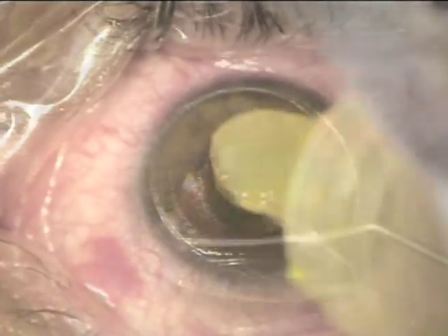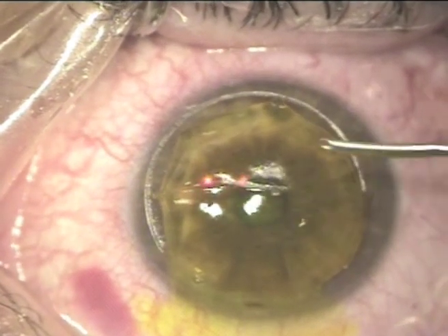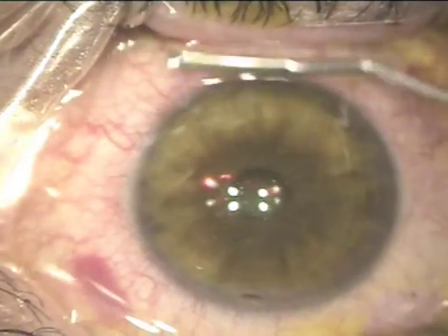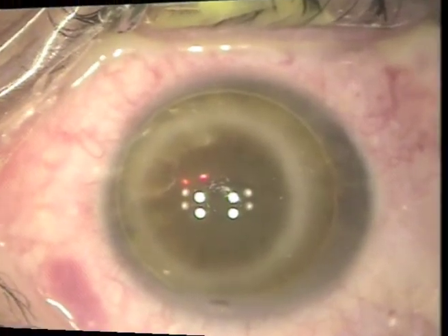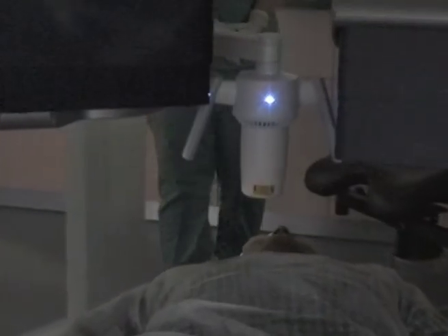A drop of riboflavin solution is placed and left in the interface for about 60 seconds. We irrigate the residual, then a drop of Pred Forte and an applanator to bring the flap back in place. You can see how the ablation gutter is also de-centered nasally compared to the pupil. Now the Avidra KXL device delivers LASIK Xtra: 60 seconds at 30 milliwatts per square centimeter, followed by a bandage lens at the end of the procedure.